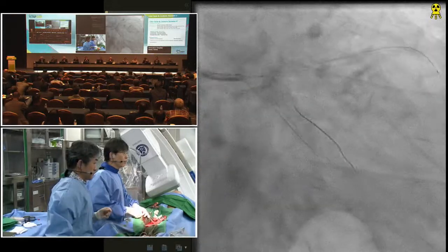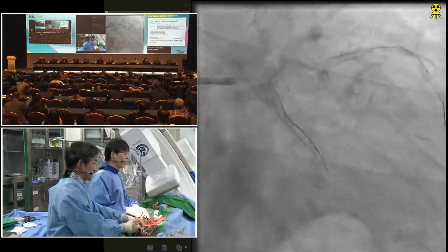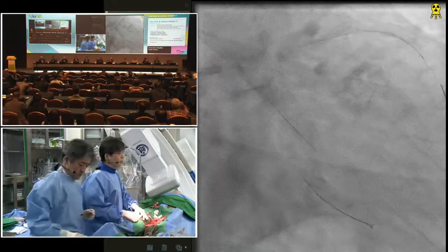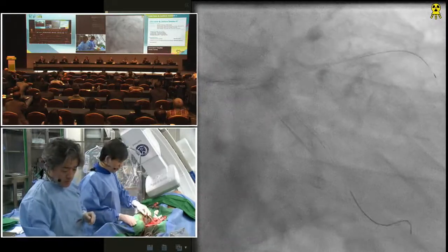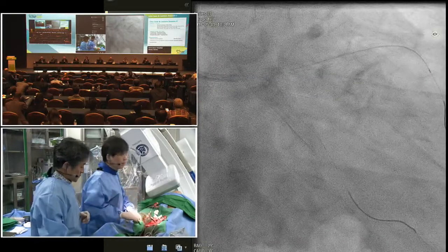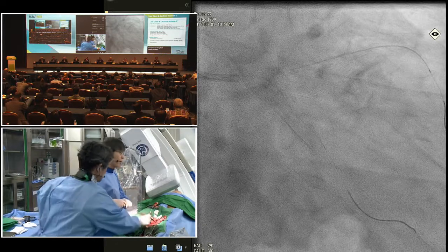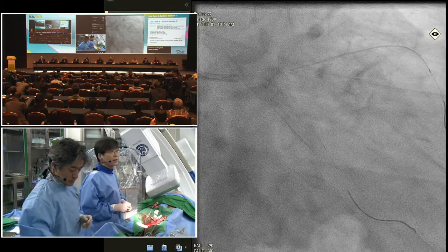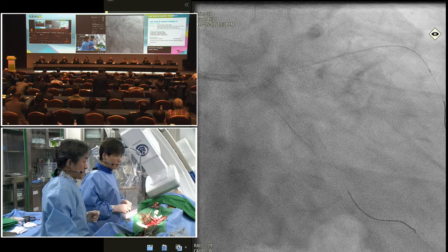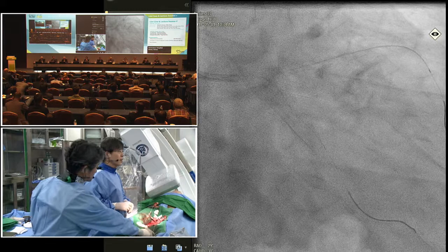Dr. Hong, what's the reason to cannulate the distal part of the circ? When I cannulate the wire in the side branch proximally, after the kissing stent, there was an IVUS finding: the stent looks like a kissing stent. There are a lot of stent struts in the bifurcation lesion. So this is the imaging-guided stent technique.